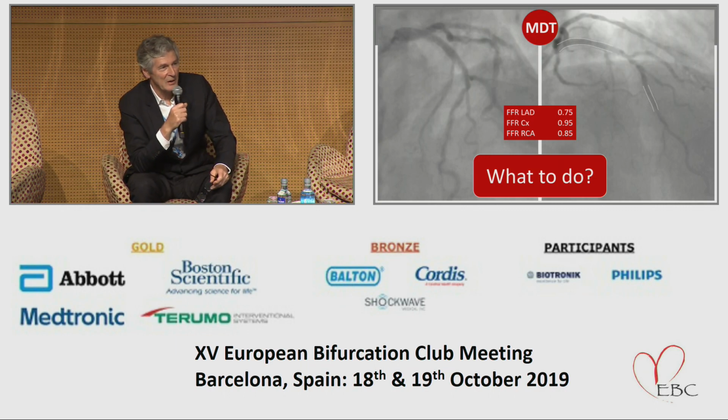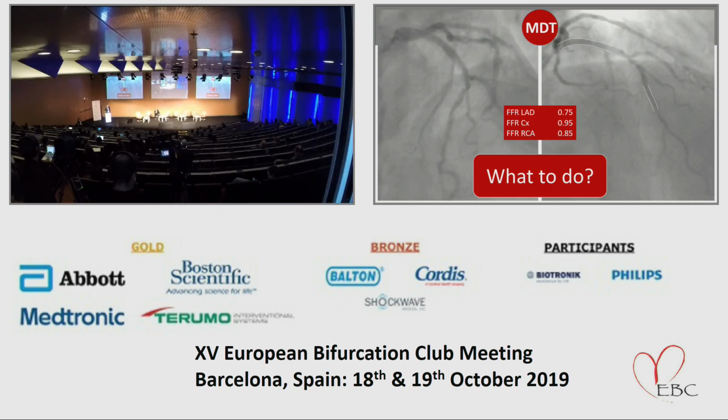Simple protection, wire protection of the diagonal and provisional with pot. So you mean keep it open, strategy for the diagonal branch? Yes. Can we do any other? Yeah. He's done well with provisional before. Yeah, it's true.